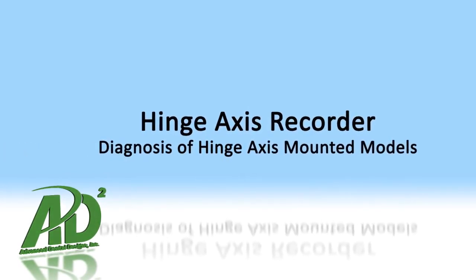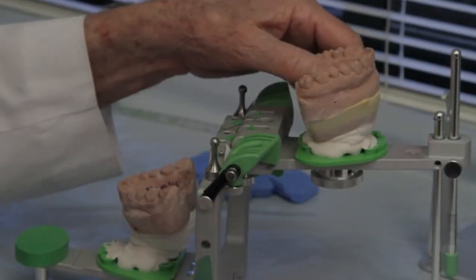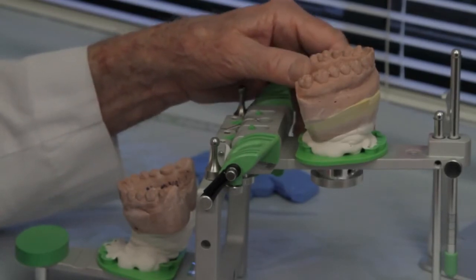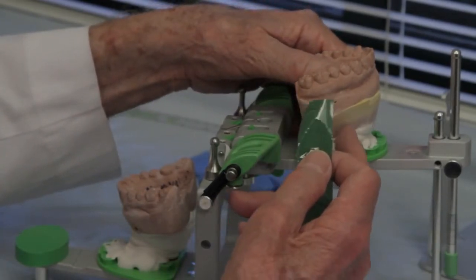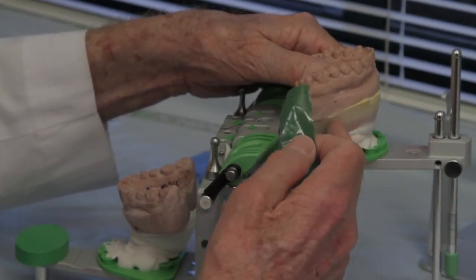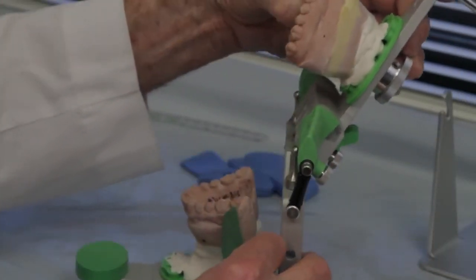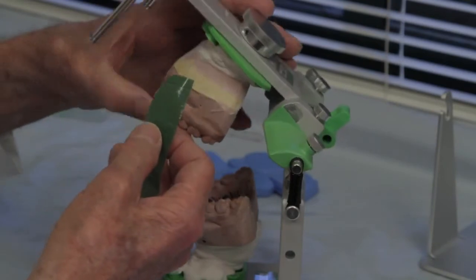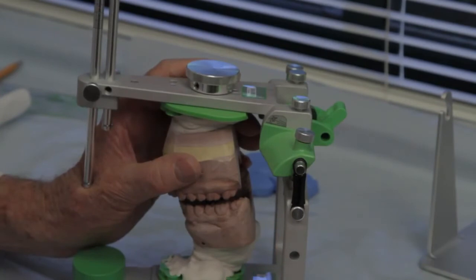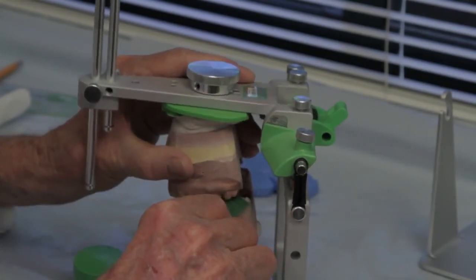Okay, I have used some Scotch tape, and I taped the split cast together with Scotch tape just to be able to demonstrate something for you. Later on, when we actually start working with the models, we'll use super glue and glue them together, and/or use stone and plaster them together so they're very firm. So the Scotch tape is a temporary measure. I first want to locate the first contact area, so I have some blue articulating paper, and I'm going to put it in the posterior area and close it down and kind of tap it a couple of times.